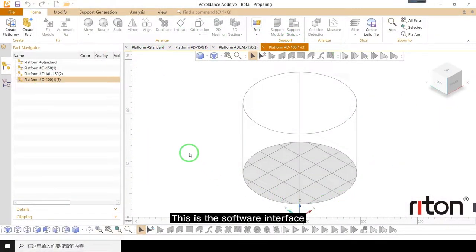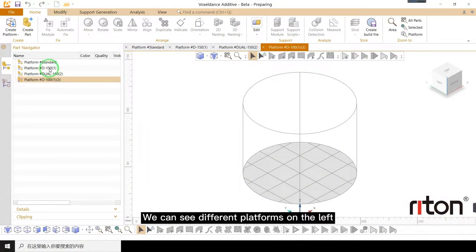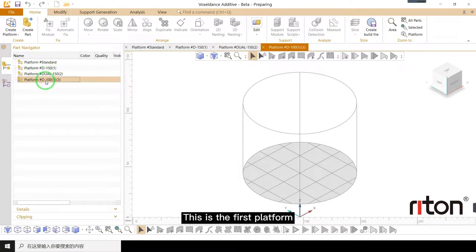This is the software interface. We can see different platforms on the left. This is the first platform.